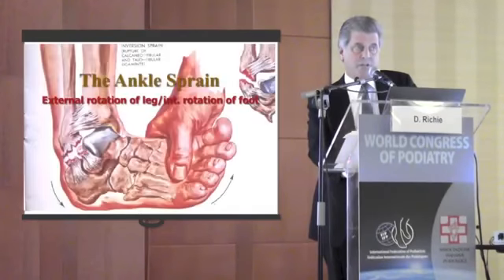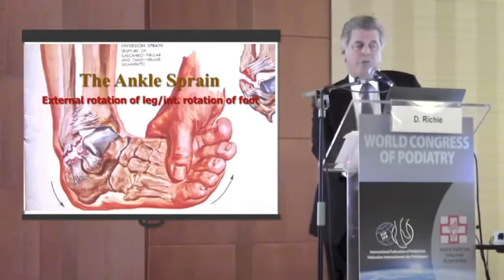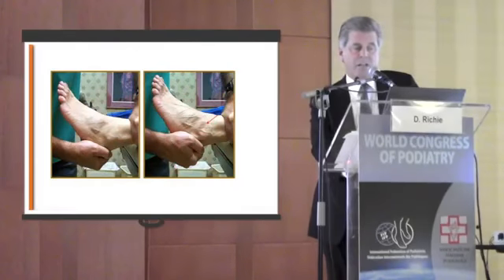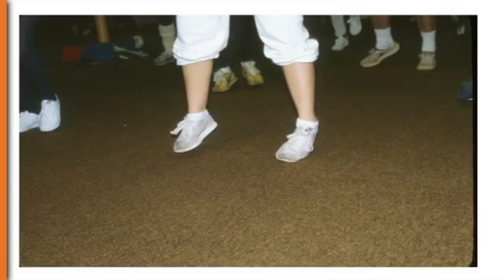Prophylactic ankle bracing, even with custom bracing, is getting more and more popular in this country. When patients lose ligamentous control over the ankle, they will go on to rapid degenerative arthritis. This is a 47-year-old patient of mine who had a neglected syndesmosis rupture or sprain that went on to complete subluxation and advanced DJD of his ankle. It left him with a varus deformity in his left foot and significant pain on ambulation.